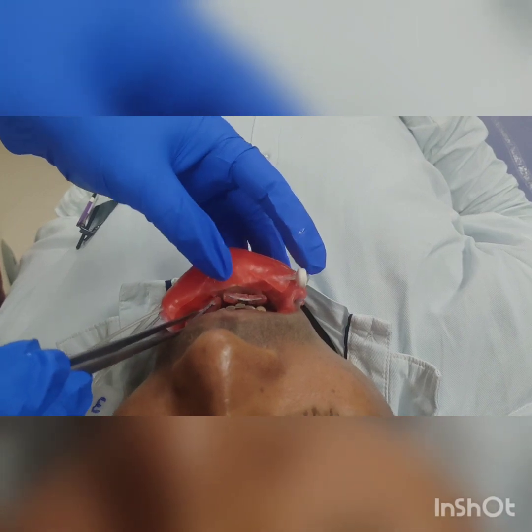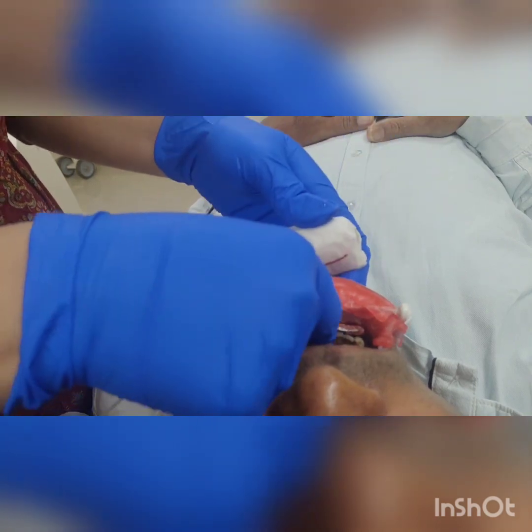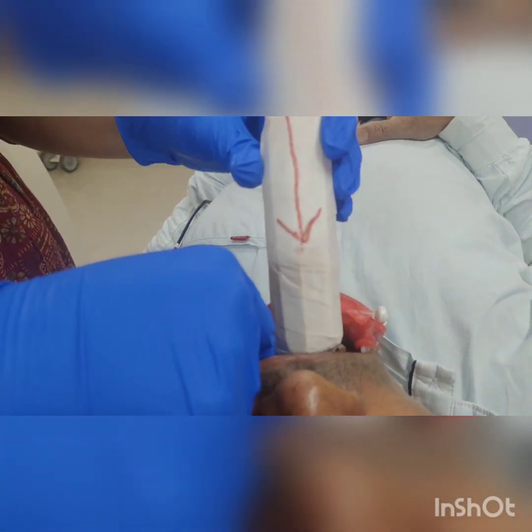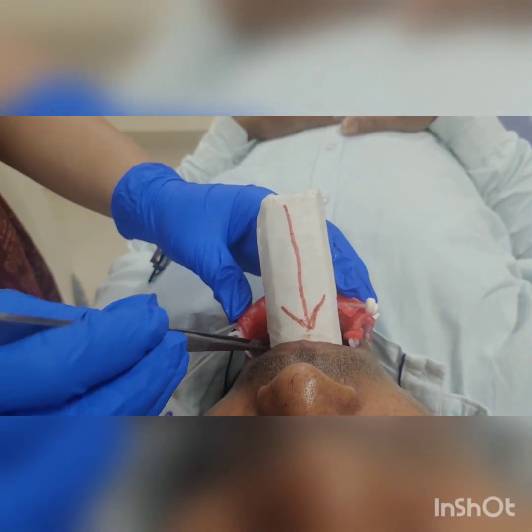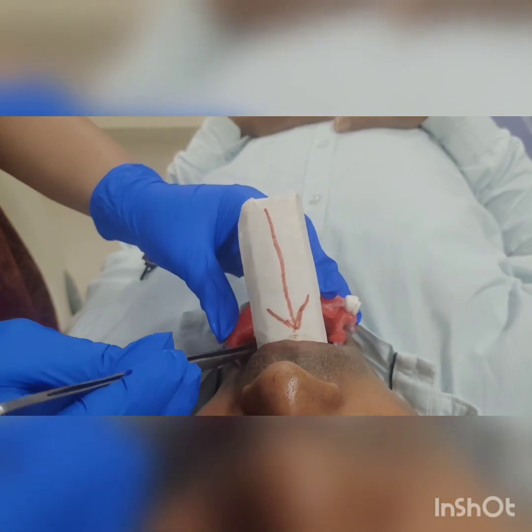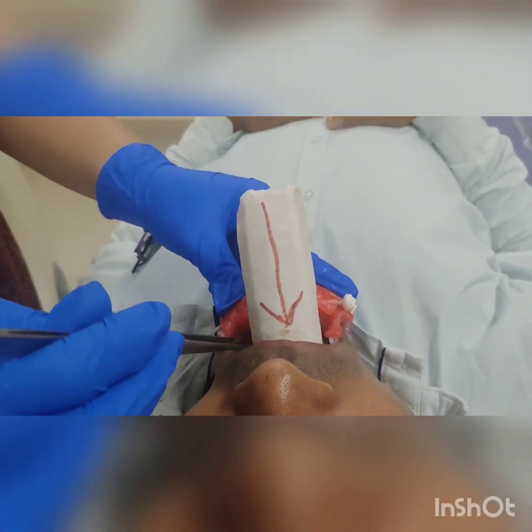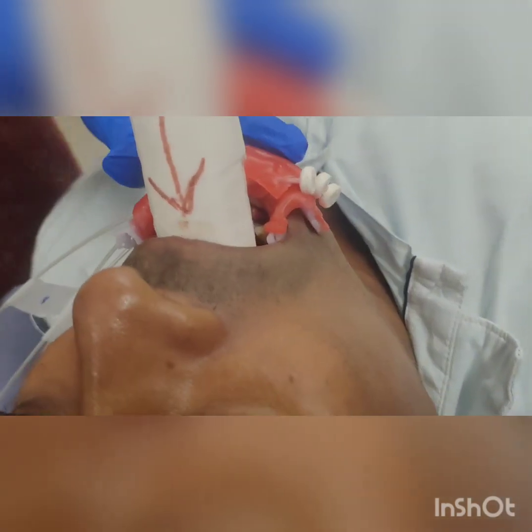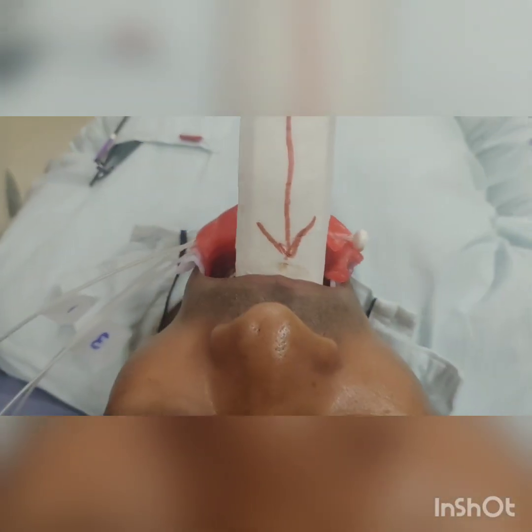Use the forcep. Now drag the leaf — place this. An internal prosthesis can be placed so that it will prevent contact with the upper lip. Ensure that the mold is touching the lip properly — there should be skin contact, otherwise it will be problematic. Skin contact is confirmed.